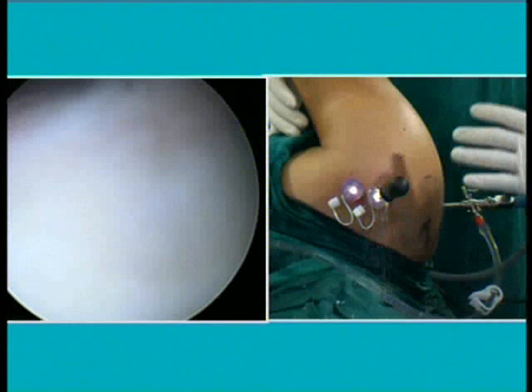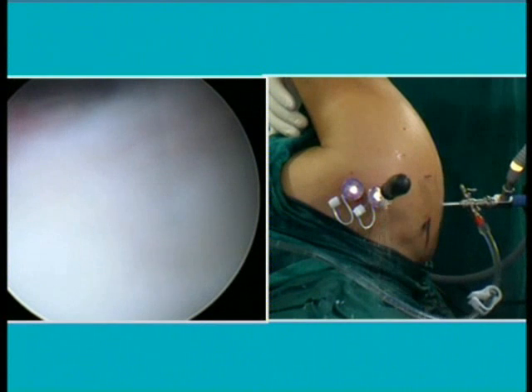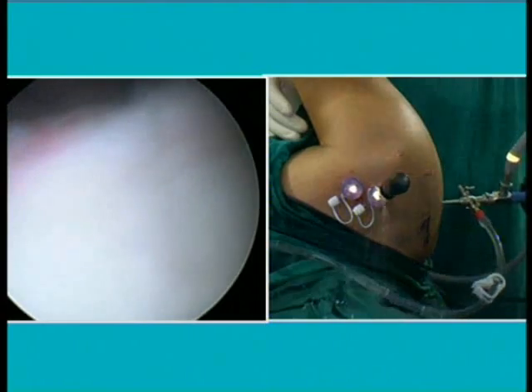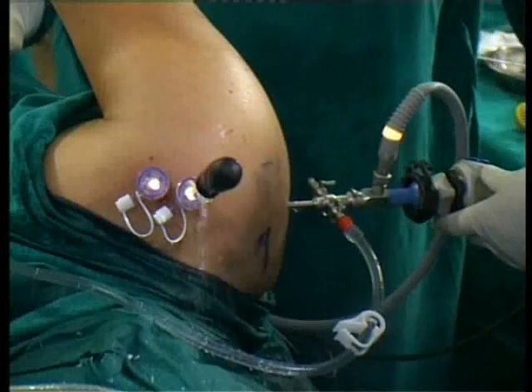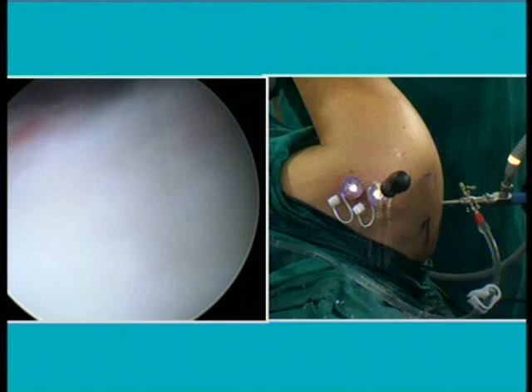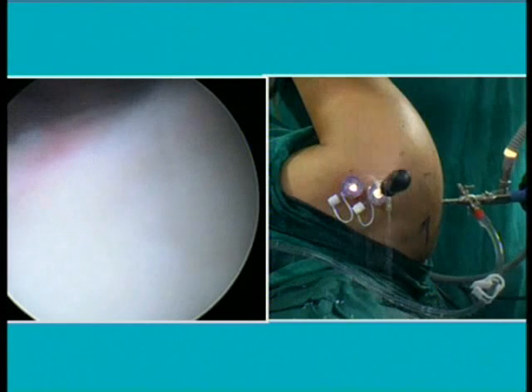So he had an MR scan done, which showed a soft tissue Bankart lesion starting from 3 o'clock to 6 o'clock. Sorry to interrupt, Sanjay. Would you be able to focus on the images again? I don't have images in the theater, but I saw it. They are arranging for it. Okay, there are images now.